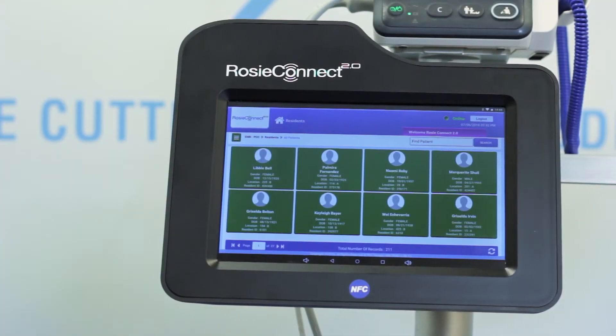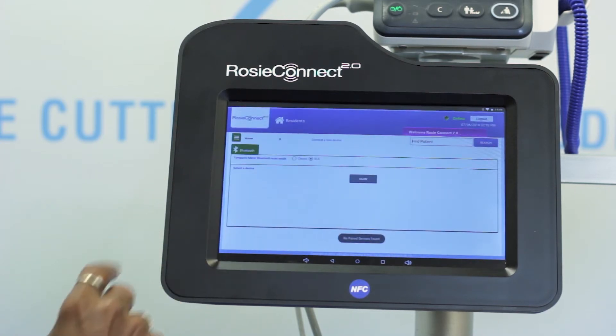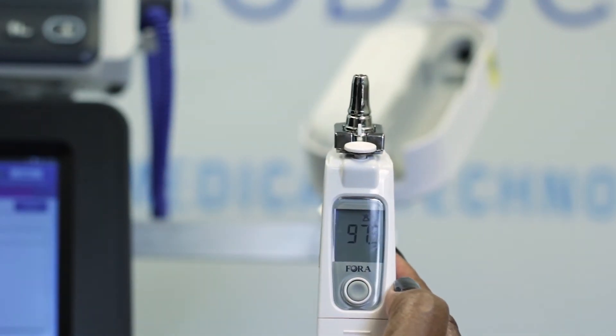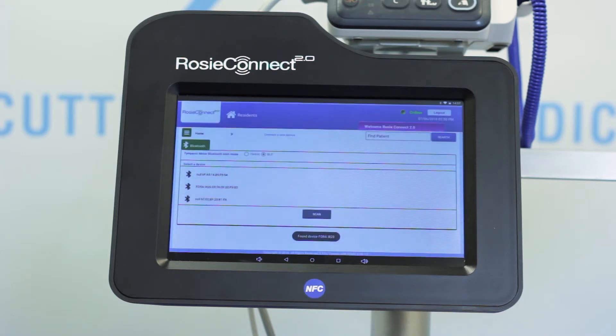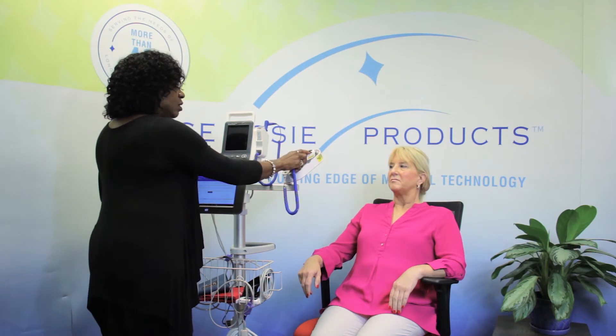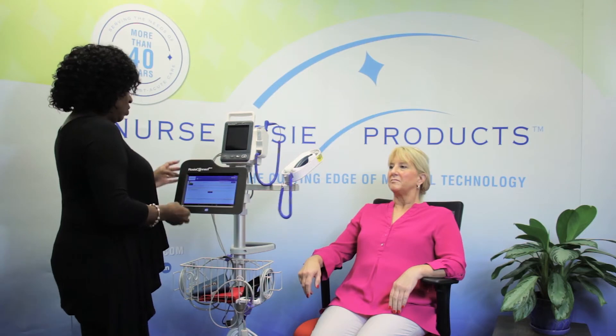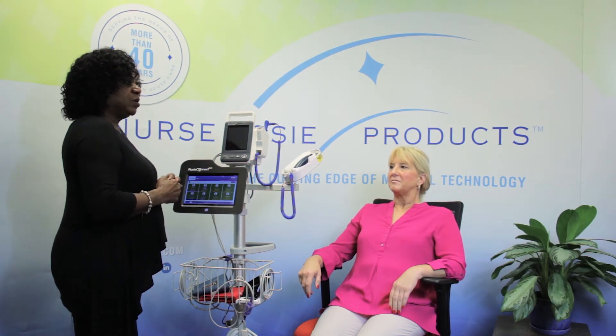From the all patients screen, find the three dashes on the upper left hand side. Touch that and it will open a menu — select Devices. Take your tympanic thermometer and turn it on by pressing the button on the belly. If you see numbers, it's on. To pair the device, put a probe cover on, put it in your ear, and tap the button on the back of the device. Then select Scan on the tablet. It will find the Fora IR20. Pop off your probe cover and put the tympanic back in the cradle. Return to the upper left of the screen and hit Home, then Home — this brings you back to the all patients screen. Now let's pause so you can pair your tympanic thermometer to your tablet.